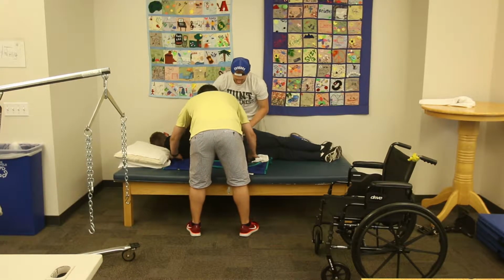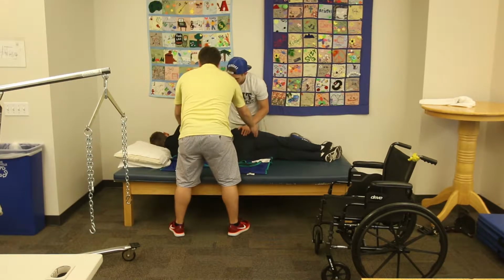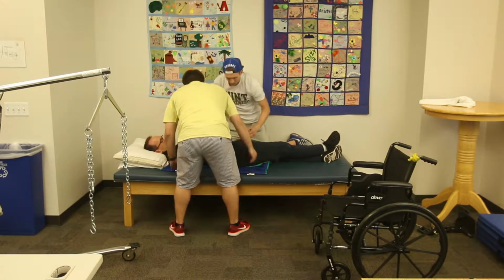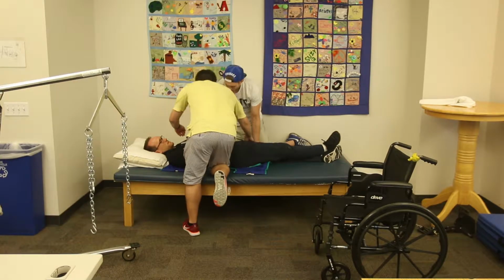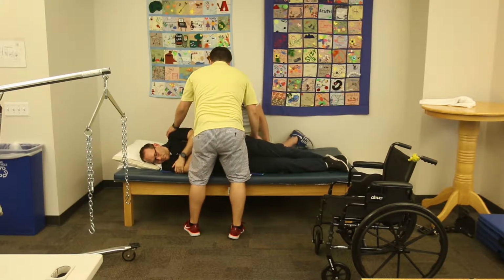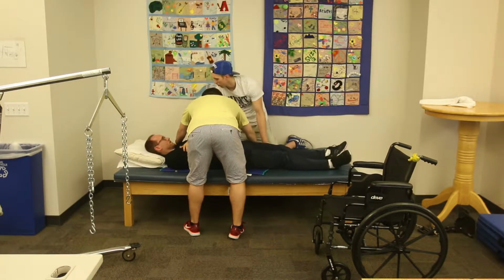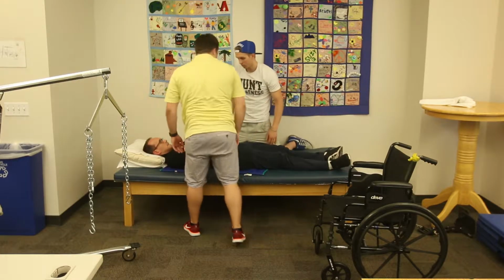All right, when we let you back down, you're going to feel a bump right behind you. That's just you going over that harness, okay? All right, 1, 2, 3. Awesome. We're going to roll you once more towards me, just to get that harness squared away. 1, 2, 3. Now we're going to lower you down. 1, 2, 3. All right. Things look good.